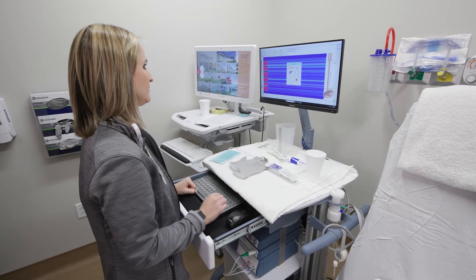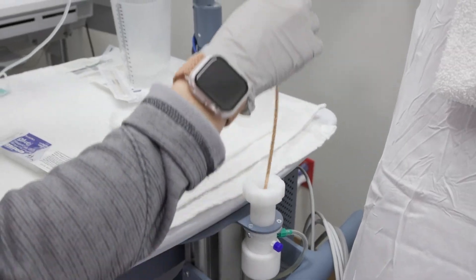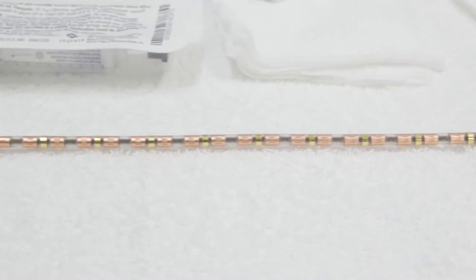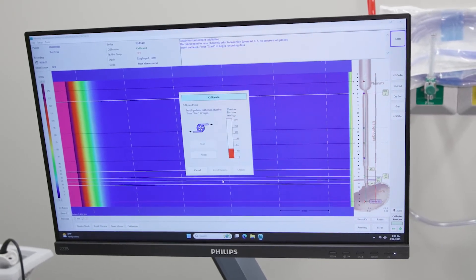Before we begin, we prepare the equipment. This includes a high-resolution manometry system with a thin flexible catheter featuring multiple pressure sensors. The system is calibrated and tested before each use.